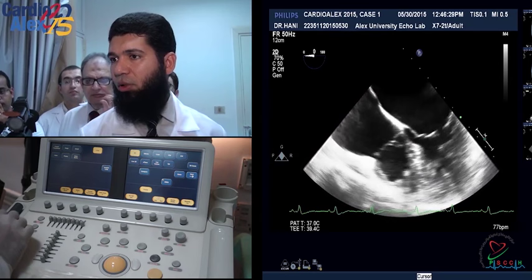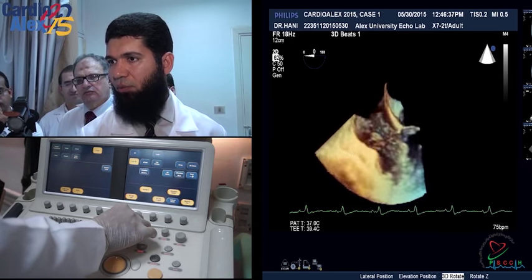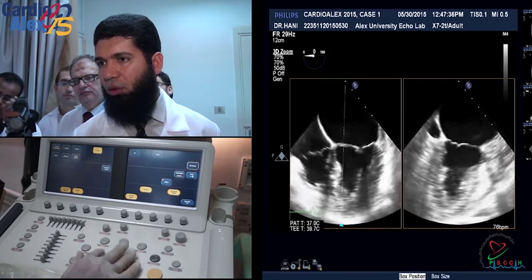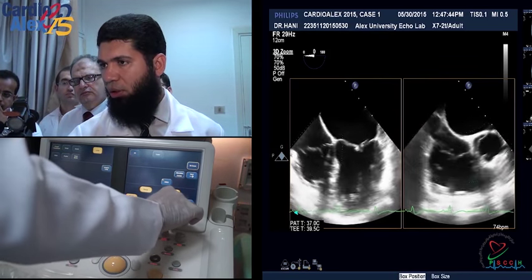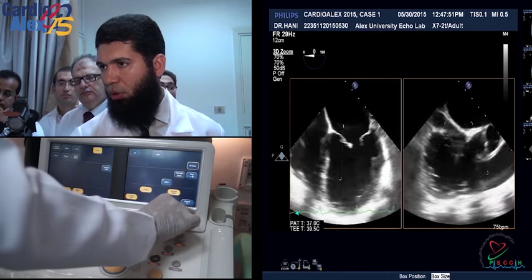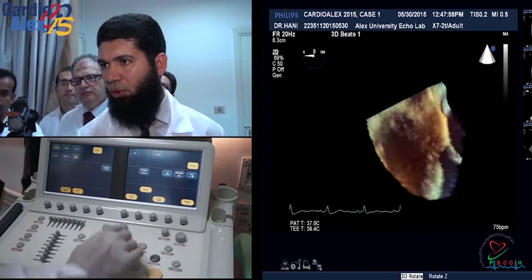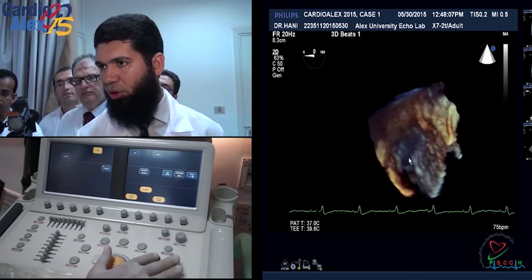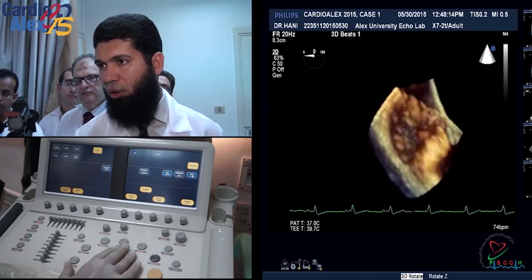For the tricuspid valve, the same approach applies — either use Live 3D with some rotation or use 3D Zoom, going to the tricuspid valve alone. In the right-handed image, I don't need all that sector width, so I'll decrease it and also decrease the depth a little to focus on the tricuspid valve. Then 3D Zoom. Decrease the gain — because the tricuspid is thinner than the mitral, it will appear thinner. If it is rheumatic and thick, it will appear much clearer. I can also view it from the right ventricular perspective.